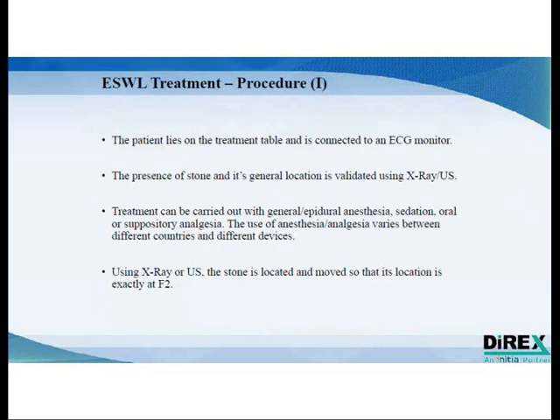The procedure itself for the treatment of urinary stones goes as follows. First, the patient lies down on the table and is connected to the ECG monitor. You connect him to the ECG monitor in order not to influence the cardiac rhythm, since you have the option of timing the shockwave treatments with the cardiac rhythm.